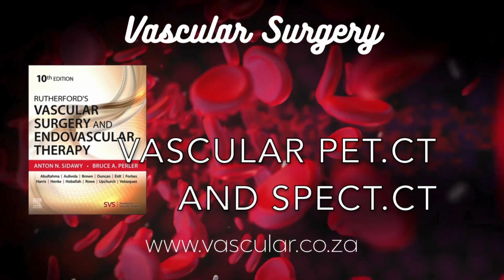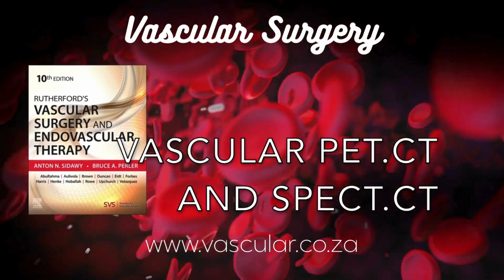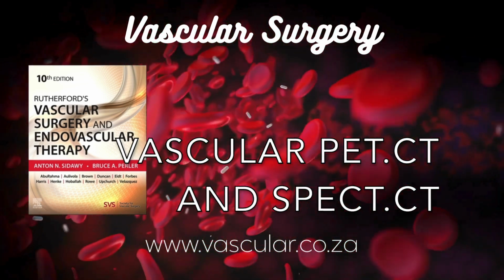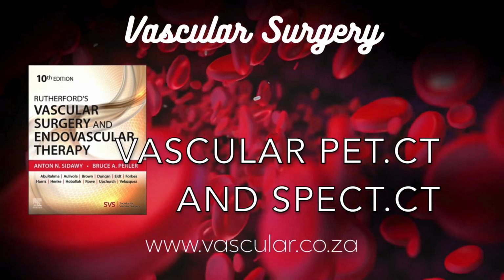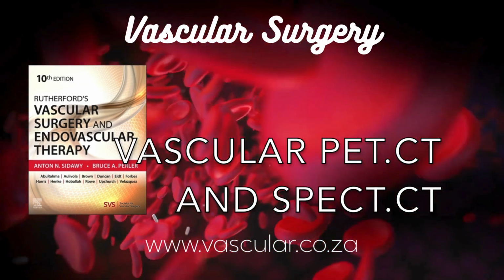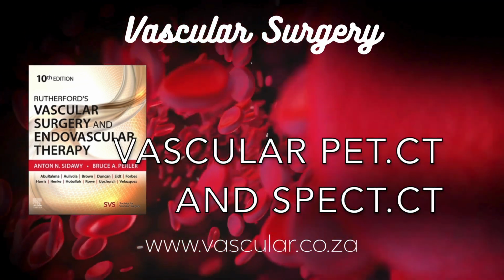Any limitations? Well, it can sometimes miss temporal arteritis, the inflammation of the scalp arteries, maybe because the vessels are small or due to background brain activity. But overall, compared to CT or MRI alone, FDG-PET is often considered superior for early diagnosis and also for monitoring treatment response in TA. Does the FDG uptake correlate with how active the disease is?